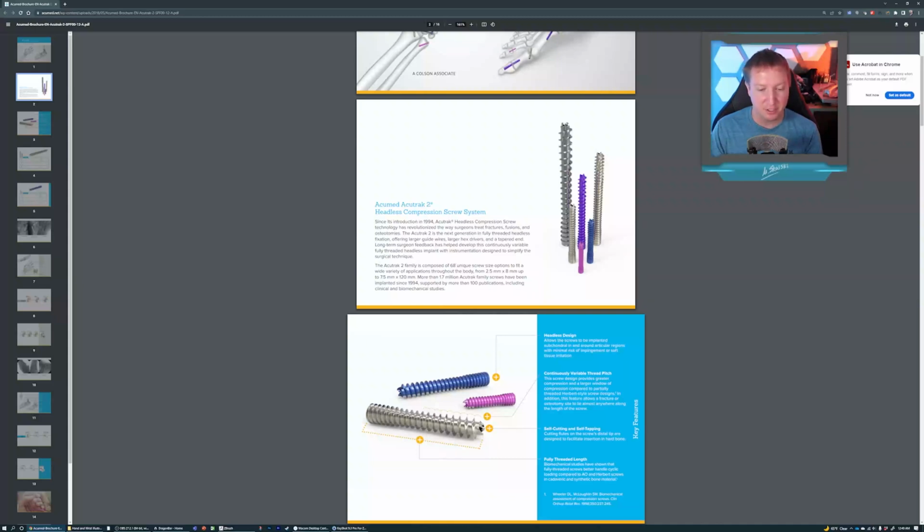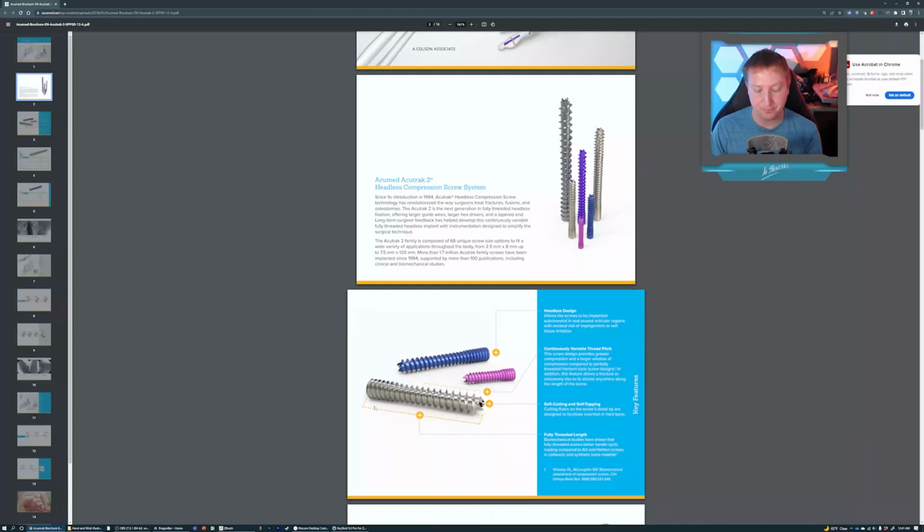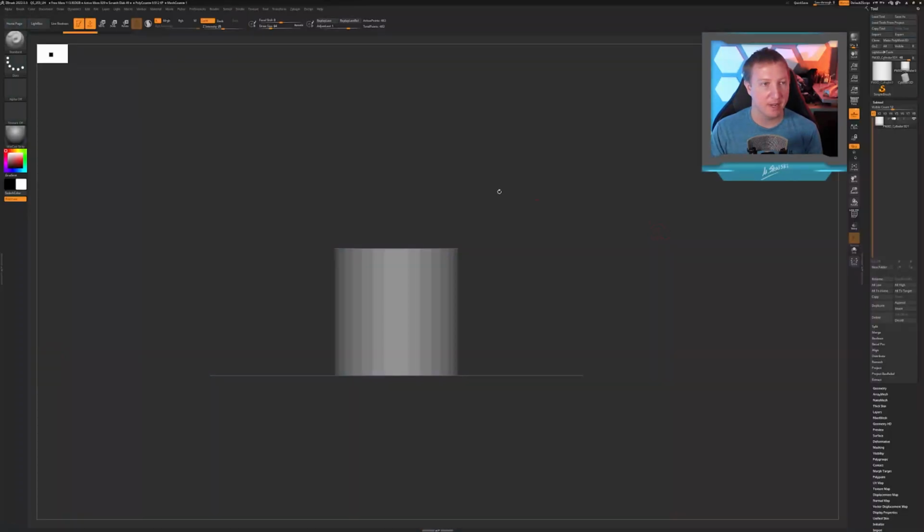And you can see that the shaft of the screw actually flares out near the base of it here to also aid in providing compression because it is a headless bone screw. So I'm going to have to create a slot in the top for a hex bit, and then a cannula down through the center. So let's jump into ZBrush here and make this thing.